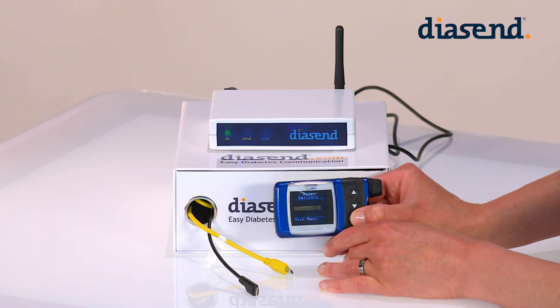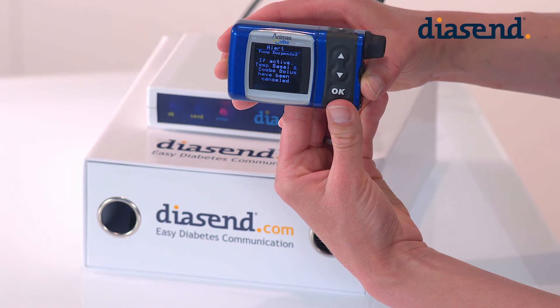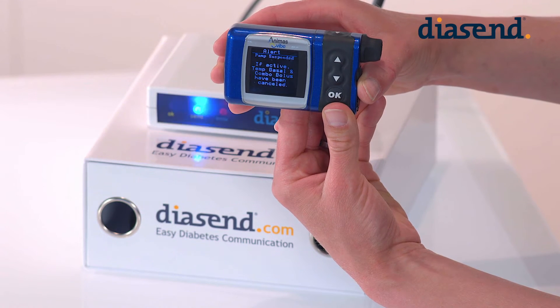Press OK. Suspend is then highlighted and you press OK again. You will see that the screen is saying that the pump is in suspend mode and it's now ready to be placed in front of the infrared eye of the transmitter.